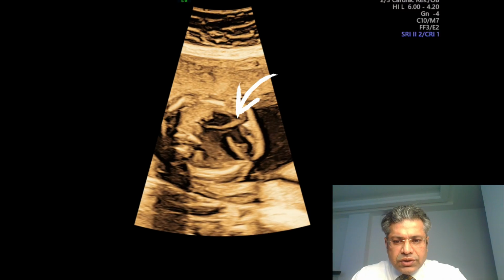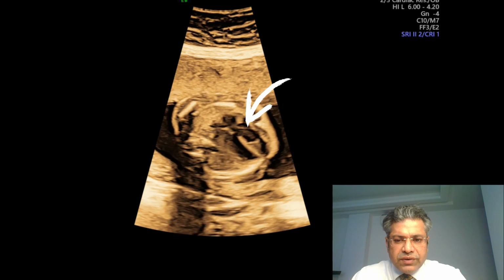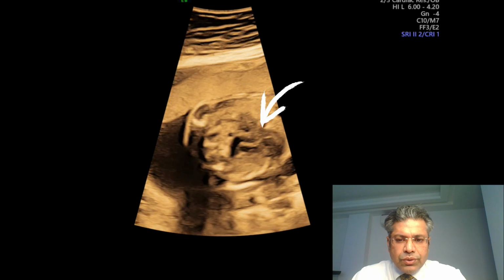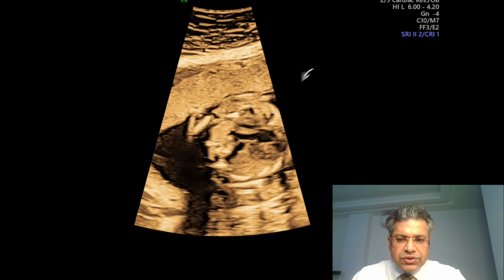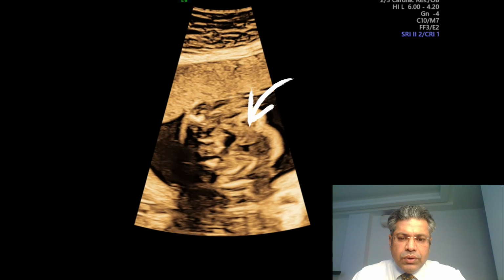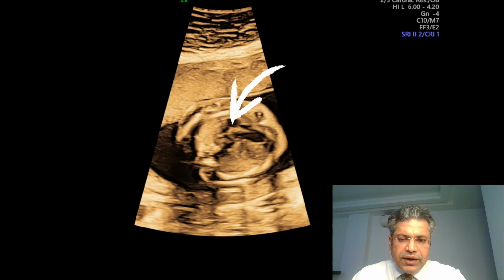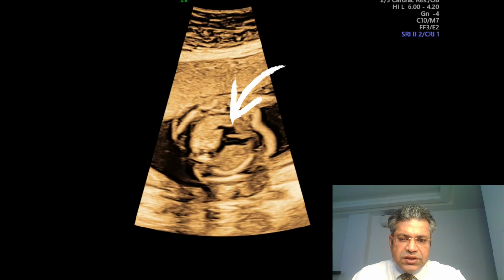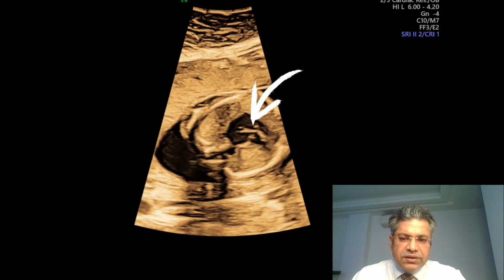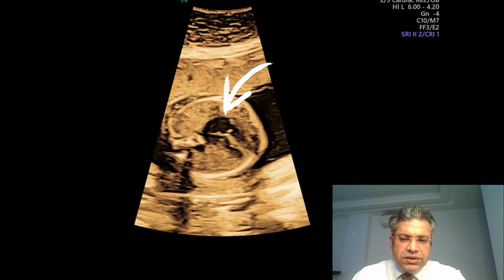This is the kind of scan that we are doing. So this is for our understanding. I have made it from a basal four chamber view, so that we can very well establish a subaortic VSD. Right, look closely, and what we can identify is a subaortic VSD. If you try to look around, initially the four chamber view can be absolutely normal if you are in a lateral four chamber view, right? And since it is a basal view, we were not very happy with this, and therefore we identified that this is a subaortic VSD.